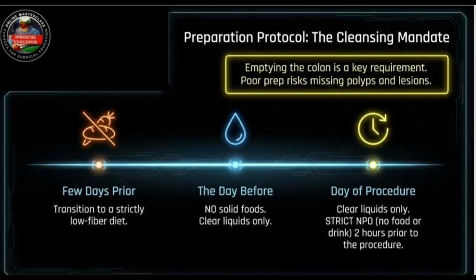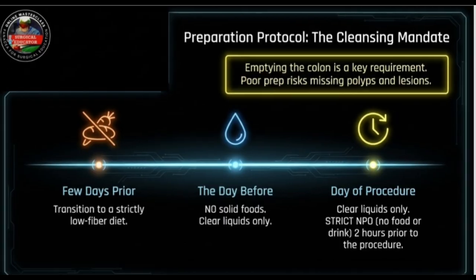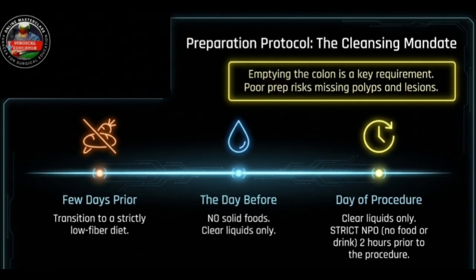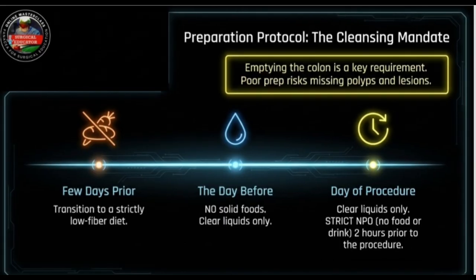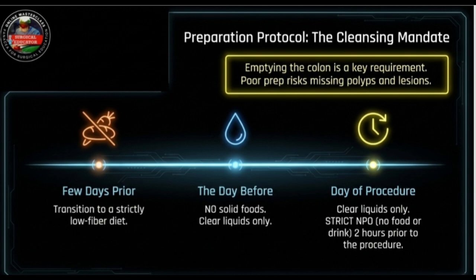Wow. Poor preparation effectively nullifies the entire purpose of the procedure. It's actively dangerous. The idea that a patient goes through this entire invasive procedure only for the surgeon to miss a life-threatening lesion just because of a poor dietary prep, that's incredibly sobering. It really is. So how do we guarantee that perfectly clean environment?